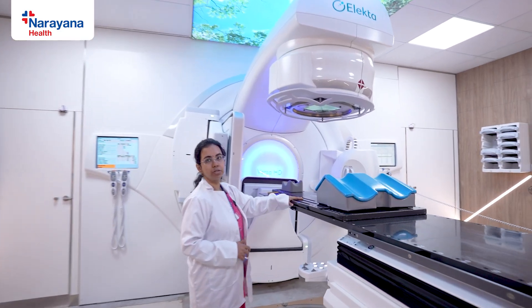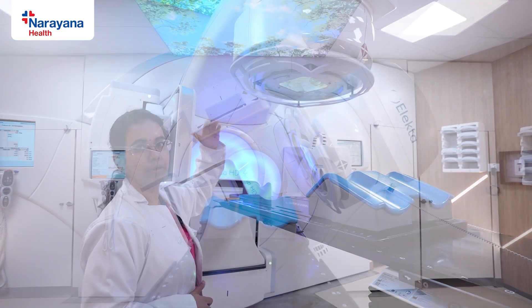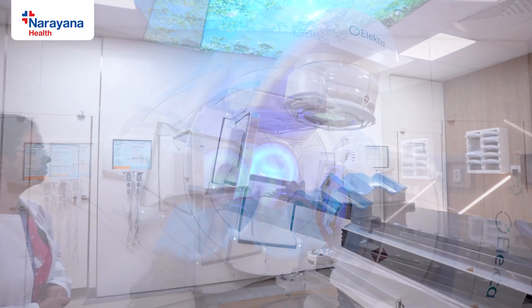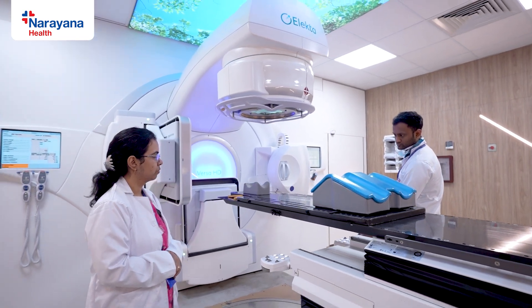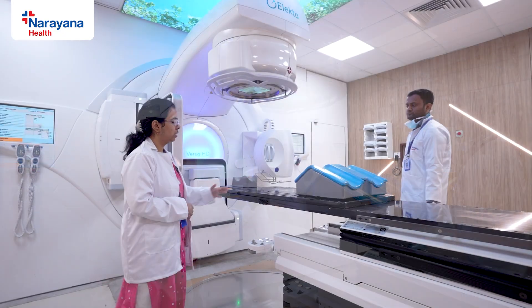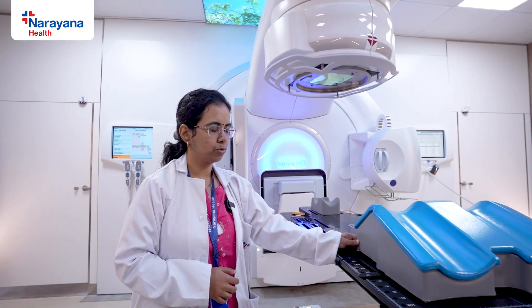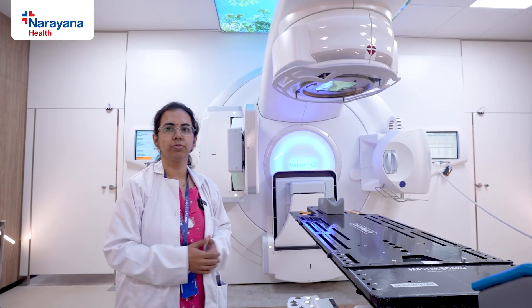When the pelvic region is positioned just below the gantry head — the treatment area — the gantry is rotated to deliver treatment. Once treatment is done, the patient's couch is moved out of the treatment field. The kneerest is also removed so the patient can get up freely and return to the waiting room.